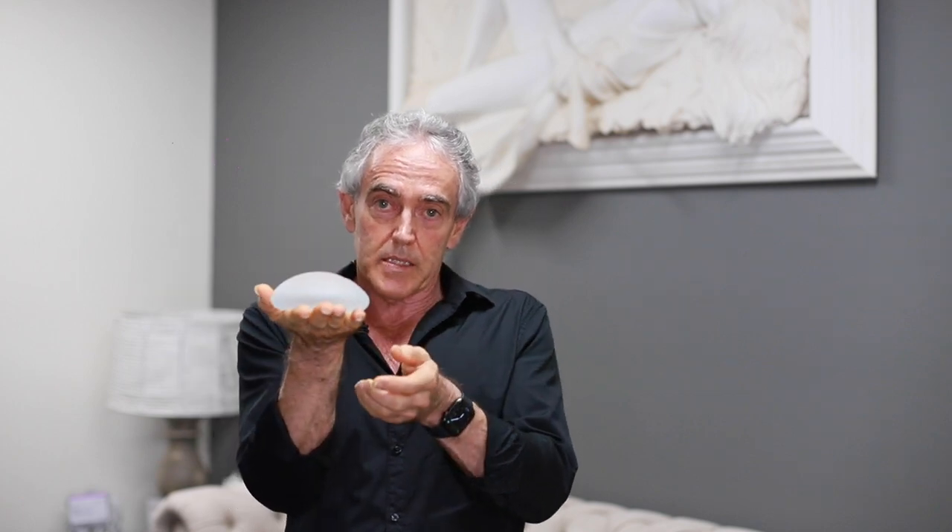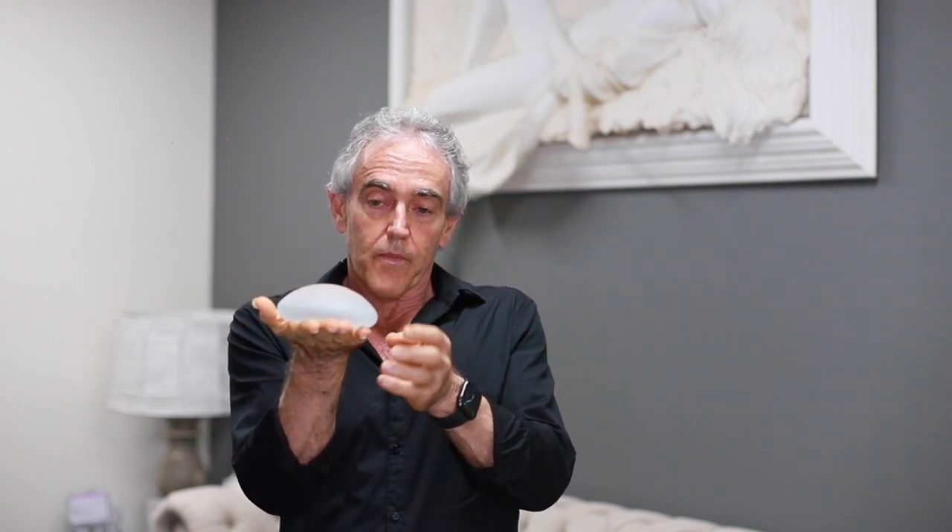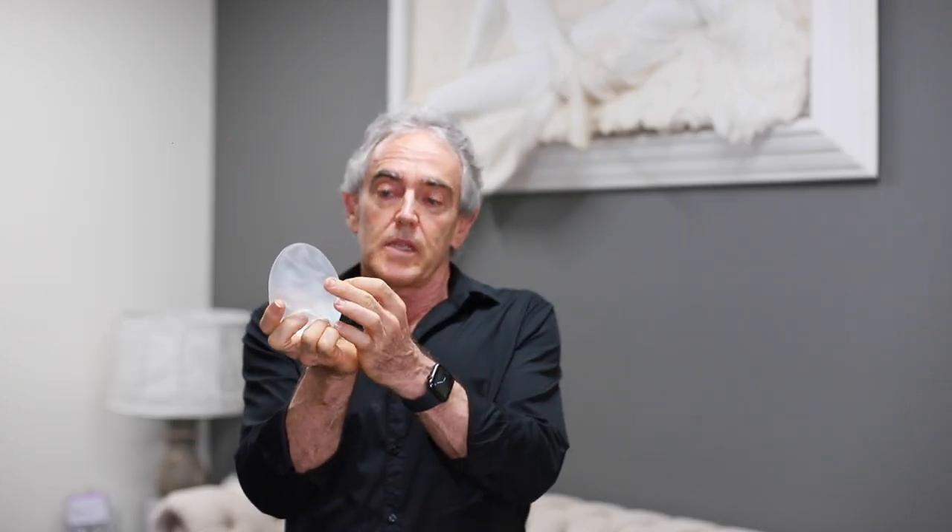I'm often asked the difference between a round and a teardrop shaped implant. A round implant looks like this — it has a curved surface and a flat base. Side on, it's basically the same shape above and below, and the nipple is placed centrally on the highest projecting part of the implant.